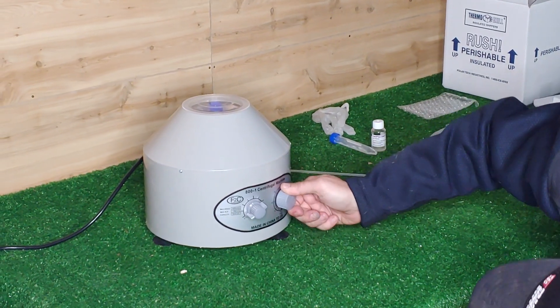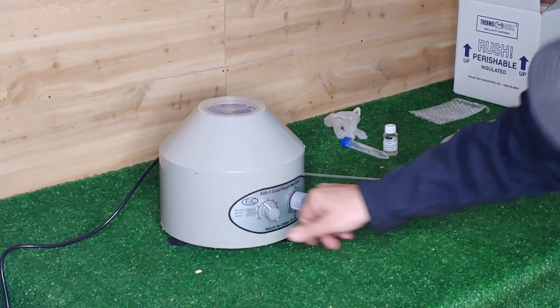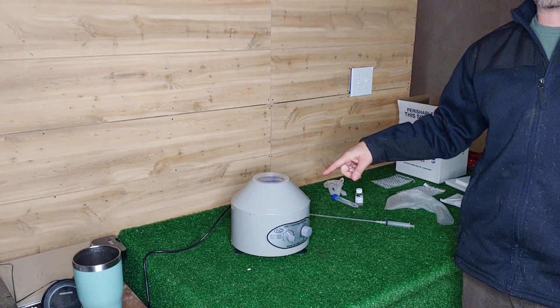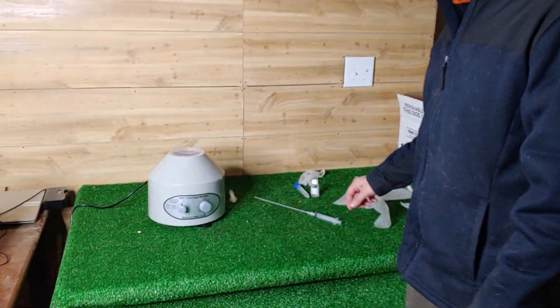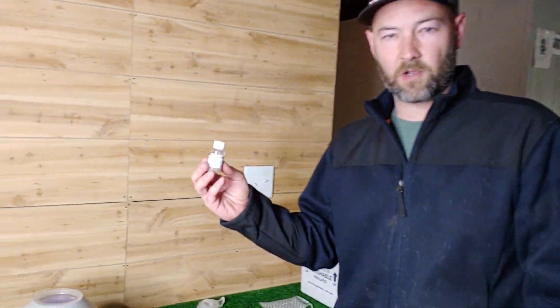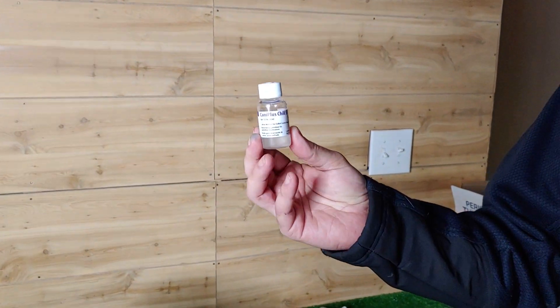We'll put the centrifuge for about seven minutes. I'll set the timer to seven and put it at an RPM of 1500. This is going to spin down the semen. When it's spun down, we're going to remove the excess seminal fluid. And this stuff is worth its weight in gold — this is our semen extender. You can see it here; this is the semen extender we use.